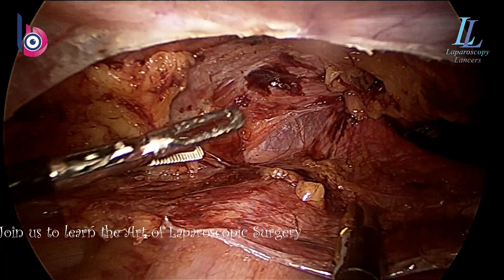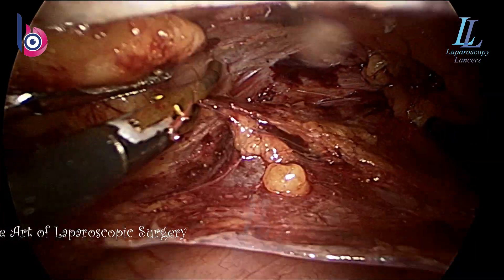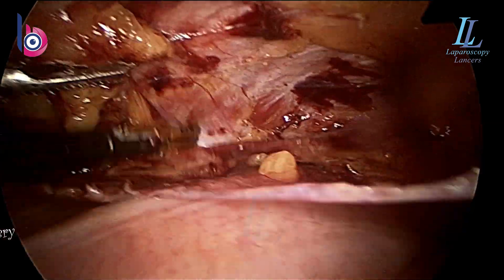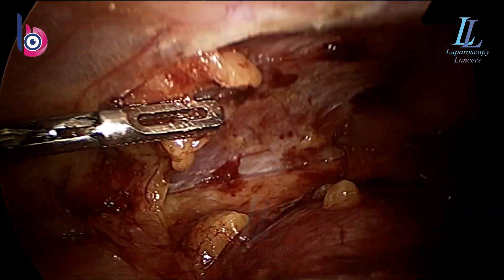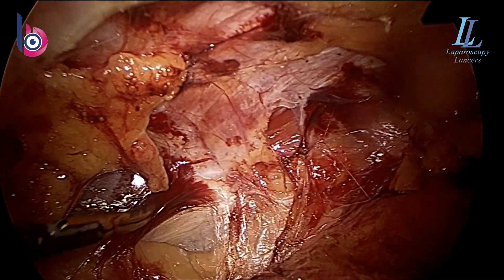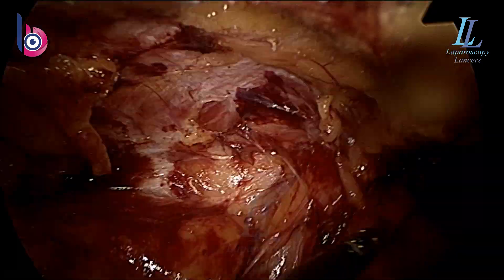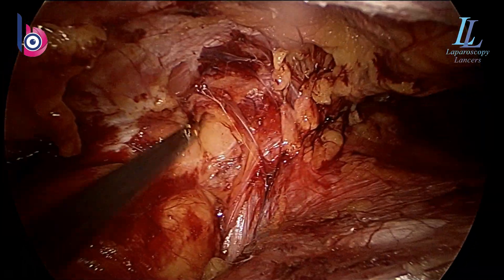Again, I will say your camera person should be excellent. Train them to twist and turn the 30-degree scope towards all sides — sometimes they have to show it from beneath, sometimes from the sides, sometimes from above. The dissection is shown in 2x speed so it will look a bit fast. The surgery is not that difficult. Do not refrain from inguinal hernia surgeries — any laparoscopic surgeon can do one laparoscopically, and it's very easy.